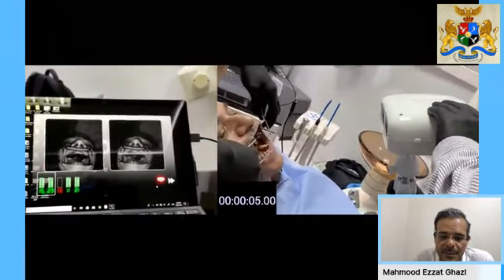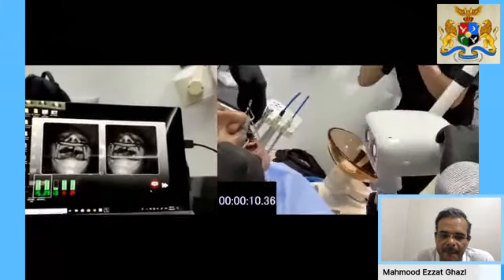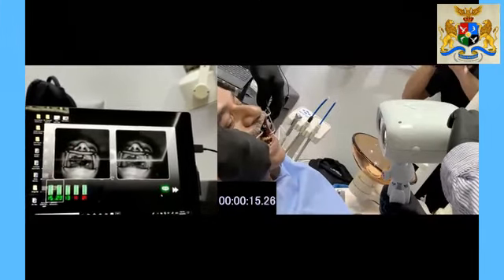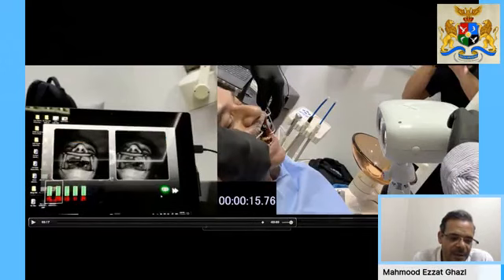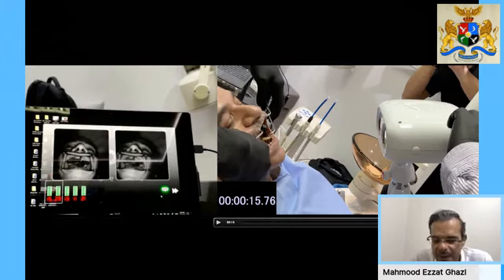Now, as you can see on the timer, in less than 15 seconds, the full scan of the 5 implant positions, all in green here on the screen, was taken. The scan was done by the CEO of PIC Dental, Adrian Hernandez. He was good enough to come along for the case, coming especially from Madrid to Cairo, so that we were able to do the case together.